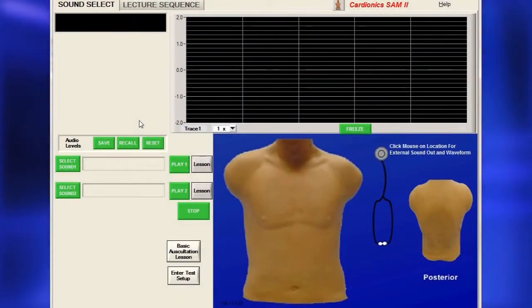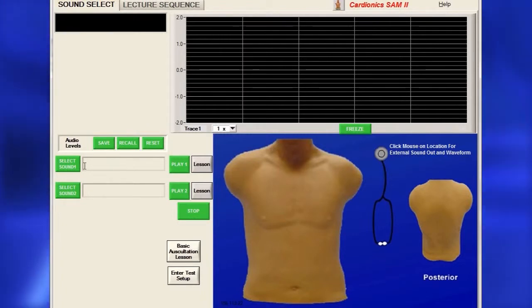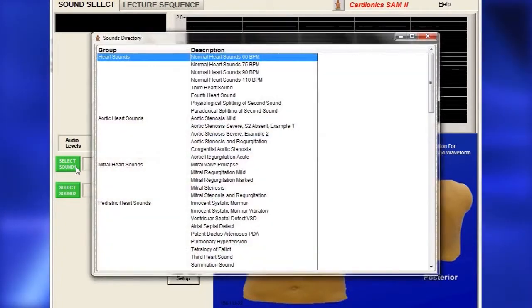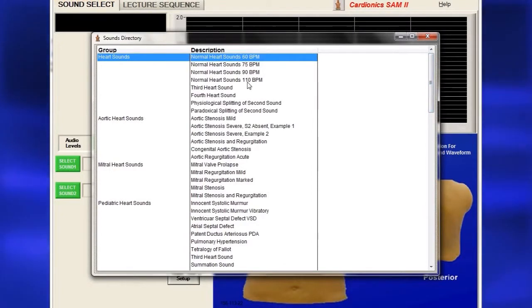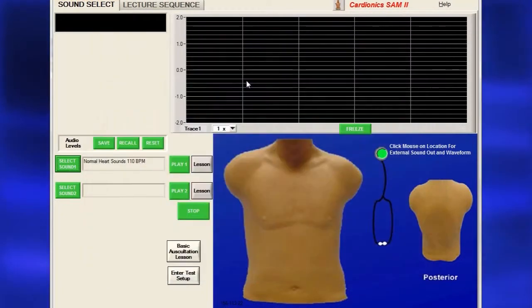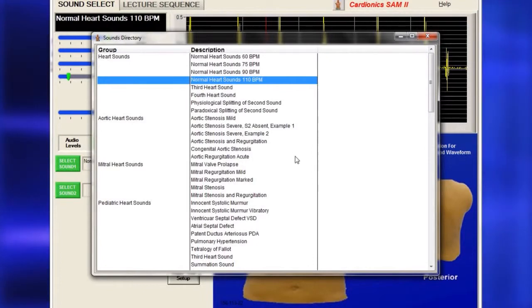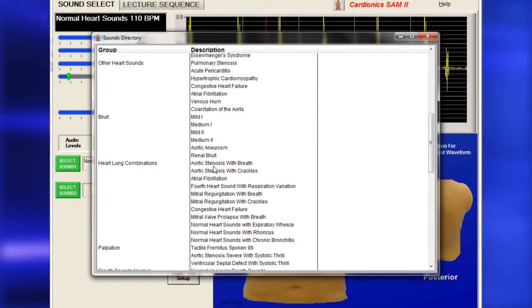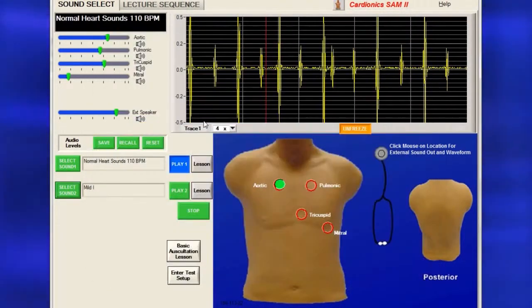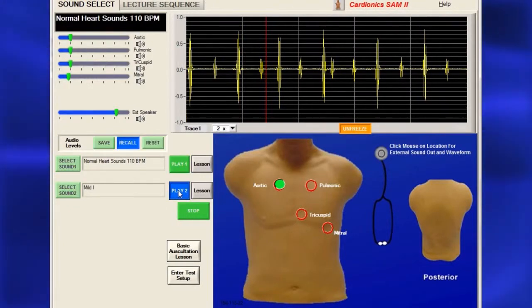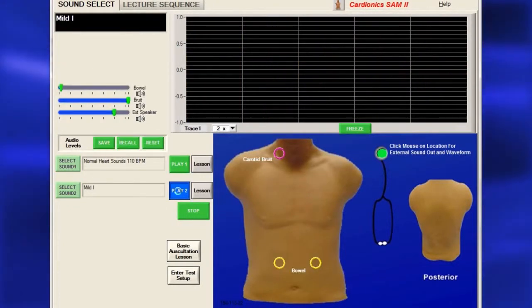To select sounds to study, on the Sound Select page, click Select Sound 1 to open the sounds directory. Highlight a sound and double-click to select. To compare sounds, click Select Sound 2, highlight a sound and double-click. You can toggle back and forth between the two by clicking Play 1 or Play 2.